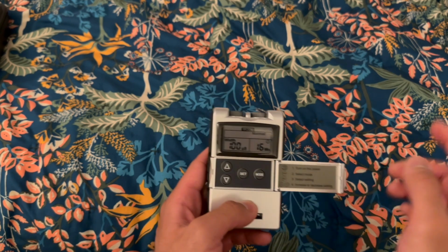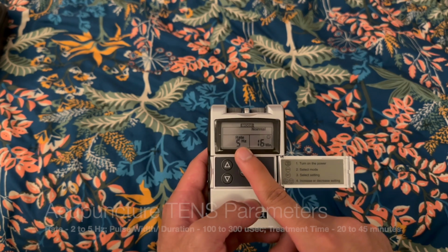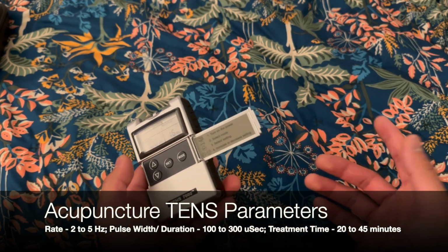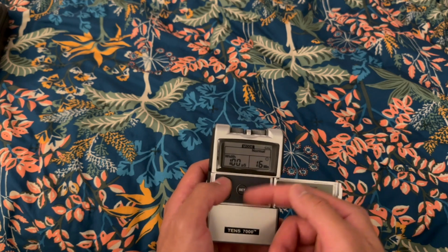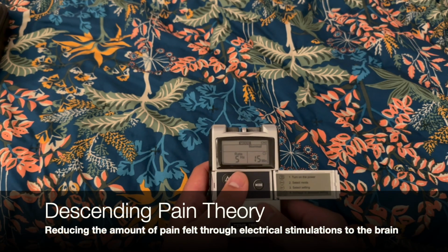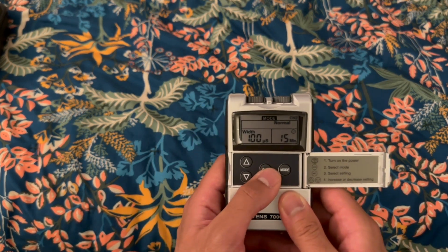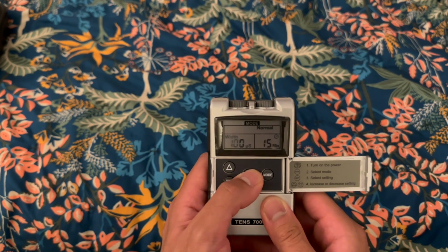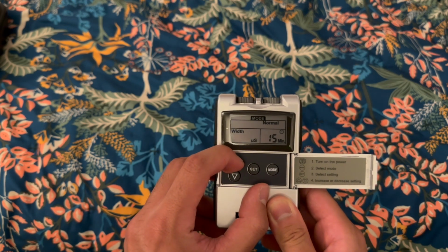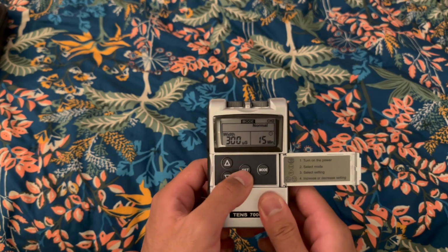So the other form of treatment that we can adjust these numbers to while we're in normal mode is acupuncture TENS. What acupuncture TENS addresses is descending pain theory, where it's pretty much sending signals to the brain to reduce the amount of pain that we are receiving. This is much better in a case for people with chronic pain issues. We'll go ahead and adjust our settings for acupuncture TENS. Right now we're changing our width. Our width can be from 100 all the way up to 300, which is the max setting that we get on this unit. We'll press set.